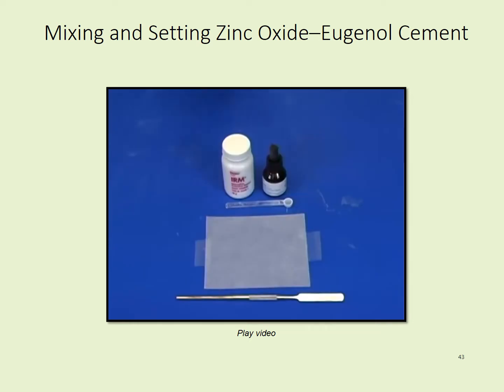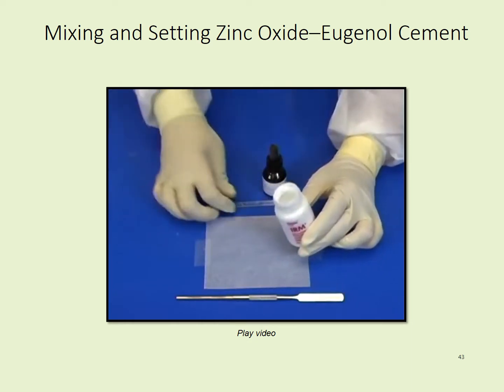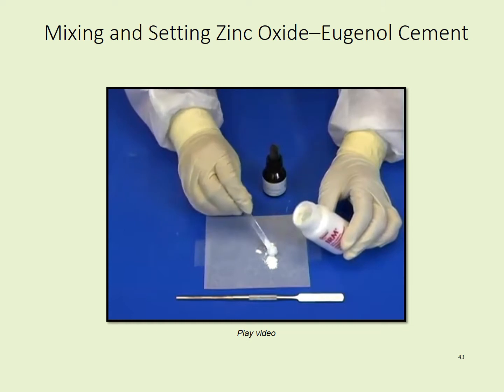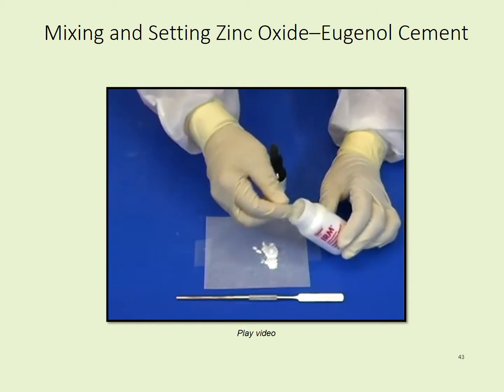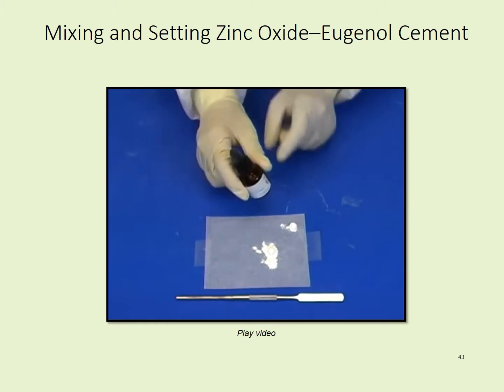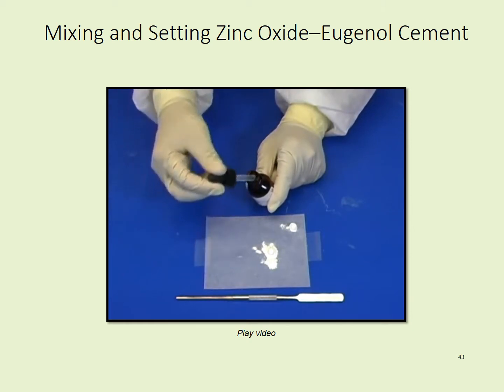Fluff the zinc oxide powder to aerate the contents and place 3 scoops on the pad. Place 1 extra scoop in a corner to be used if needed. Shake the liquid bottle and dispense 4 drops of liquid on the mixing pad. Make sure the powder and the liquid do not touch.